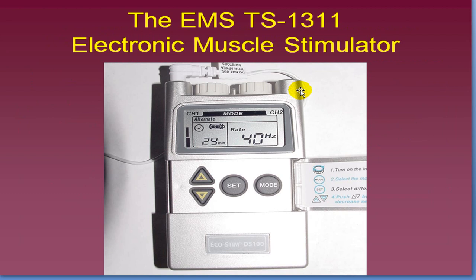We are going to be using the EMS TS1311 electric muscle stimulator. It looks like this. It has a little closed off section on the front that you can flip open. When you flip it open, you can see all the digital readouts up here. So you've got some abbreviations here. You've got channel 1, channel 2. We've got a mode that we can change by this button. We've got our battery indicator here. We've got our rate. We'll talk more about rate in a minute. You've got some simple directions here.